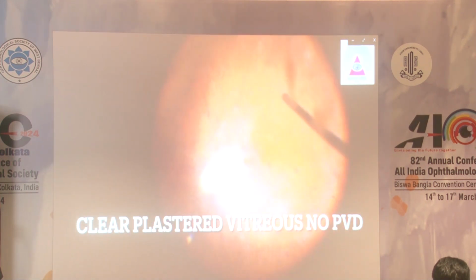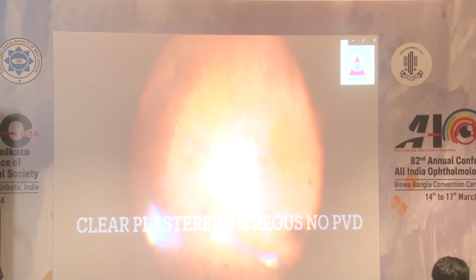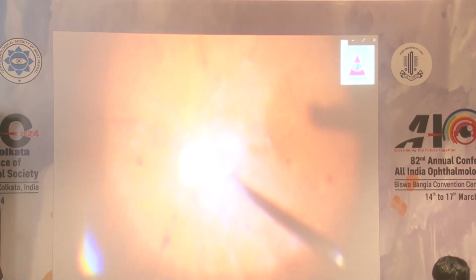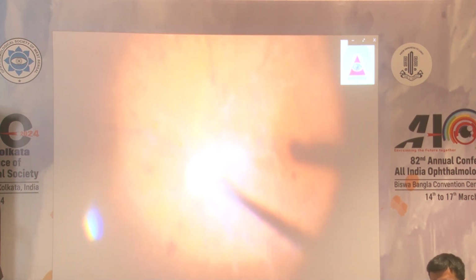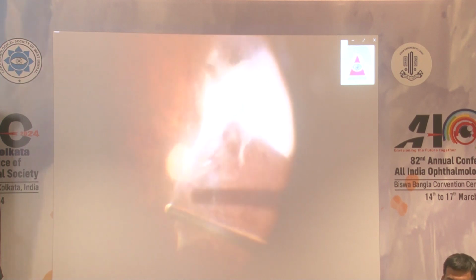The next case is of a clear vitreous with no posterior vitreous detachment, and the vitreous is plastered to the retina. These are the cases where staining is useful for identifying the vitreous and inducing PVD.